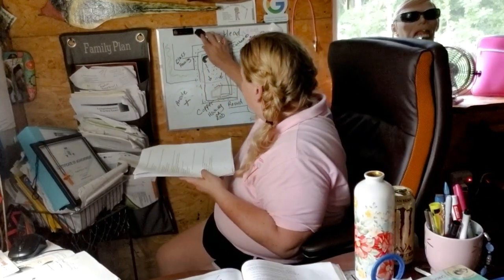Okay, but remember, when you're putting that film in, this is the unit. This is the automatic film processor. You're standing right there in the dark room. You're feeling for it. You know what I'm talking about. You open up the film packet. You're going to feed it in, right?